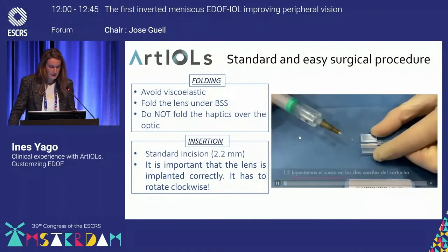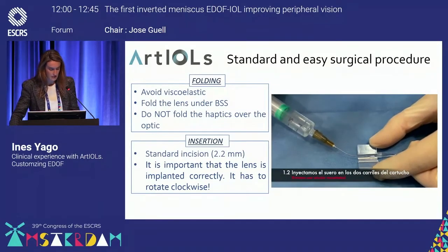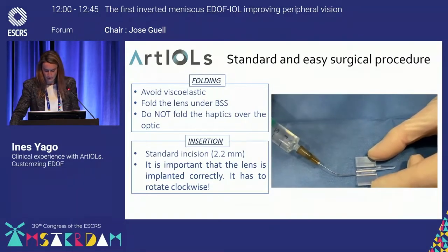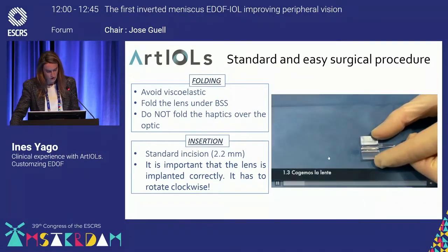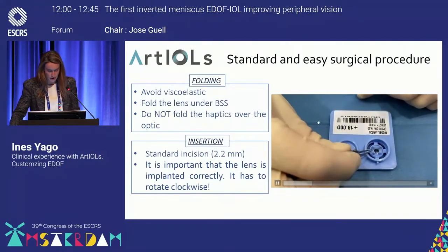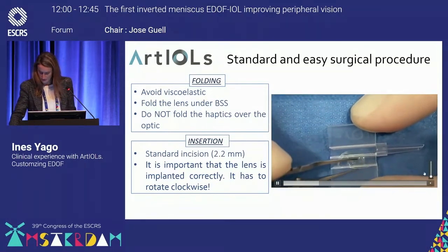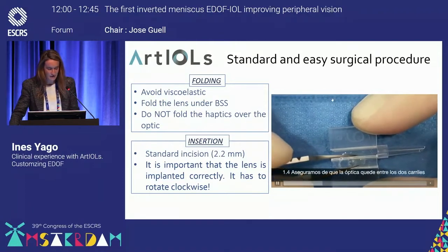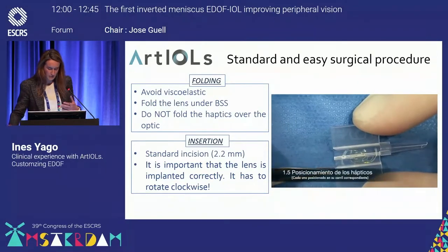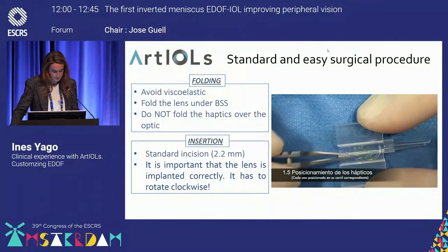I know Pablo has explained the lens in detail, but I would like to give you some tricks about the folding and the insertion of the lens. I would recommend not to use viscoelastic material during the folding of the lens inside the cartridge. Instead, I usually use BSS, and I would also recommend not to fold the haptics over the optic really tight, because they can stick together and it could be a little bit challenging to detach both haptics once the lens is inside the eye.